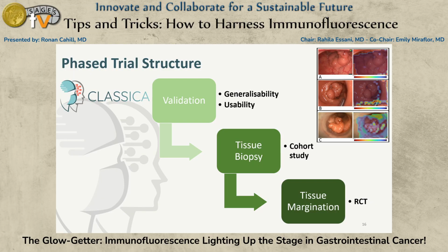The first one is the validation of the general mathematical principles, and we're just concluding that now. So that's trying to see, does our initial mathematical concepts still hold in a bigger patient series from more diverse patient population groups, and it does. The next 2 studies are the more interesting ones. This is when we're going to deploy the software in real time, and we've had to build out the software to a regulated clinical device in order to do study 2 and 3. So that's where the first 2 years have been spent.